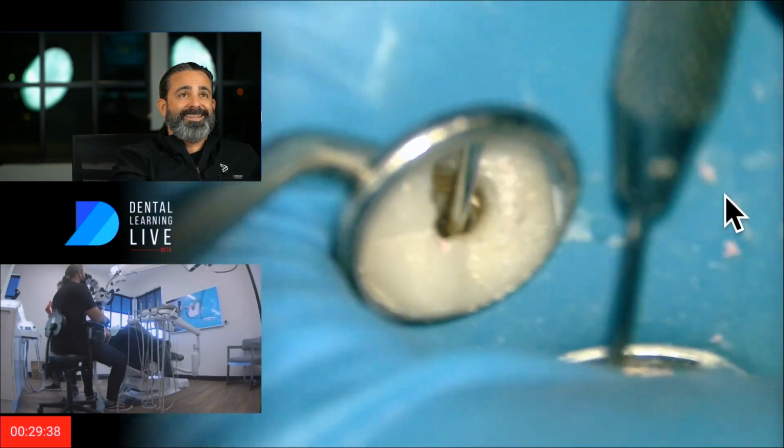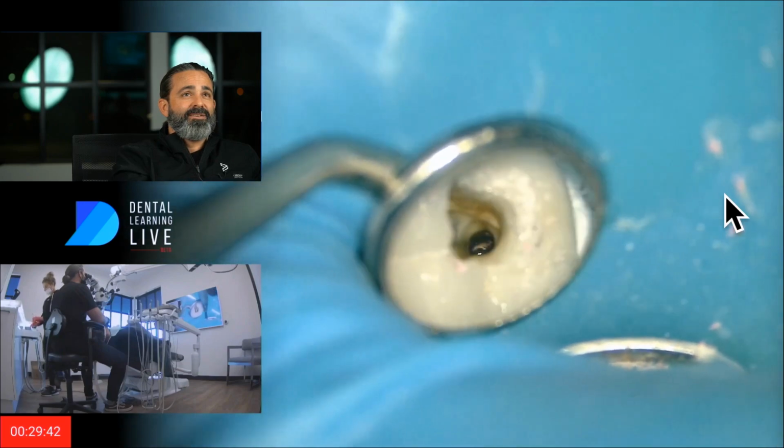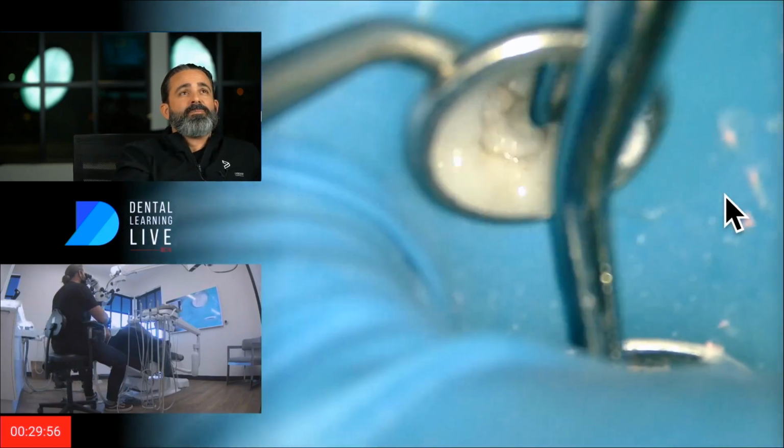Still see some of that in there. Now this one's in the palatal, but it's still there. And I'm just kind of jumping ahead.